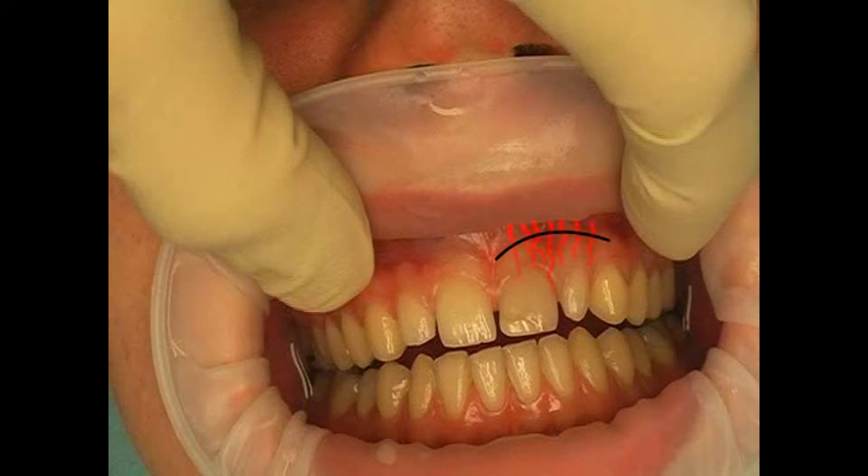Because most of the blood vessels, shown here in red, run along the axis of the tooth, this kind of incision cuts many of the vessels.